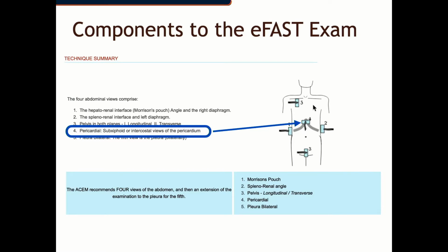Then I am going to clear the anterior lung fields. I will clear first left because I'll be on the left for cardiac, and then I'm going to go to the right lung field. At that point, I'm going to change my preset. I'm going to do right upper, then left upper quadrant, and then the bladder. And the bladder must be scanned sagittal and transverse, 2 scan planes.